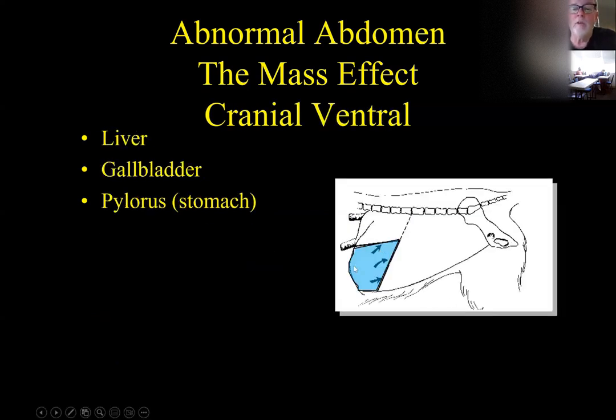So let's go to the cranial ventral abdomen now. If something forms in that area, becomes too big, and pushes everything away from it, what lives there? Well, mostly it's going to be the liver in that area.